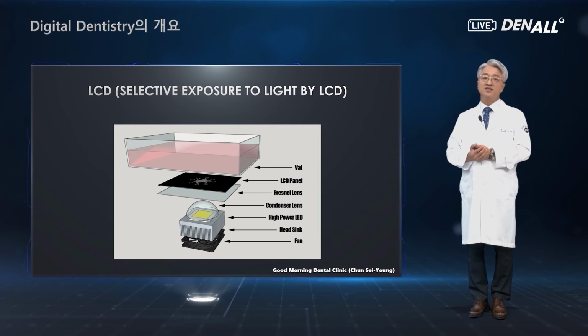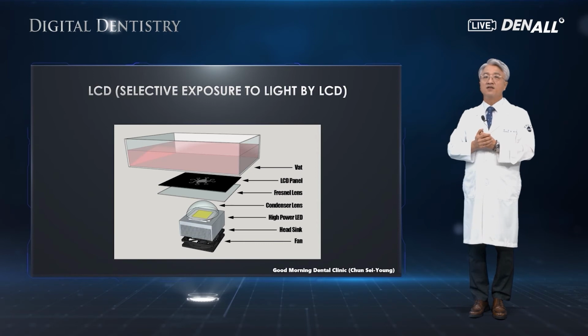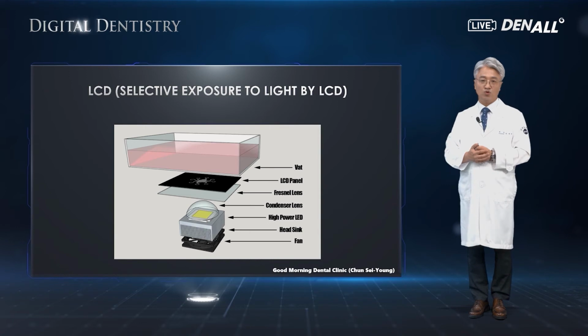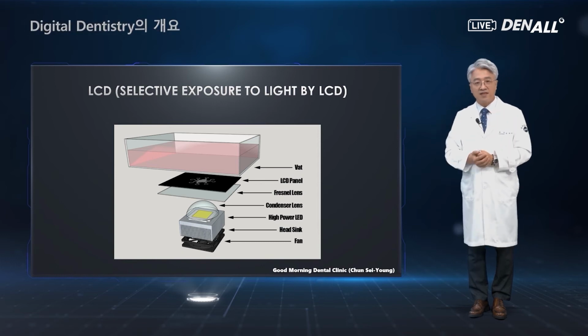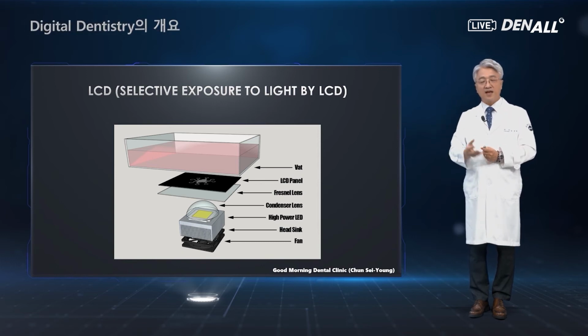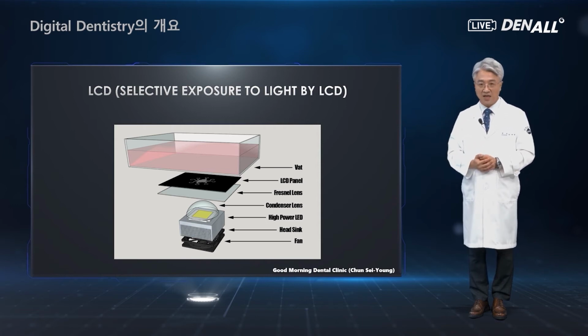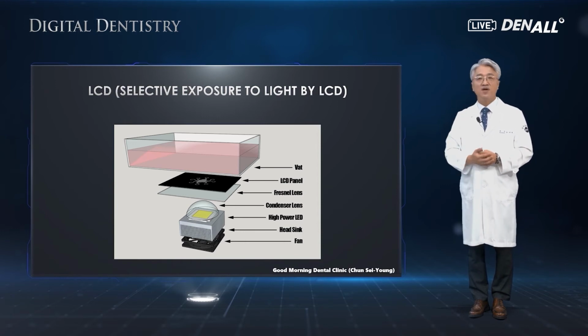In the case of LCD printers, from the LCD display, it prints directly in 1:1 ratio. So it has a great advantage over the previous two. But a lot of heat generation is one disadvantage. So the resin can be overcured, or because of the heat, LCD has a short life. You need to consider the advantages and disadvantages, and you need to select the most appropriate printer in your dental office to approach one more step closer to the digital dentistry.